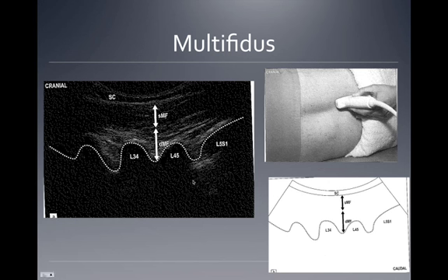Okay. And here we are for our multifidus exam. They're doing this one in side lying. We're actually going to teach this in prone, but it's also been shown many times in side lying. You're going to come over the spinous processes and move just slightly laterally. Okay, so they've moved in this case superiorly in this picture, but you're going to find the spinous processes.